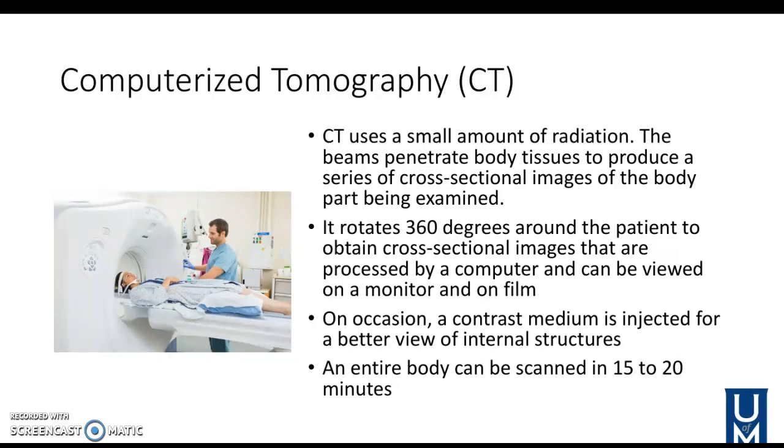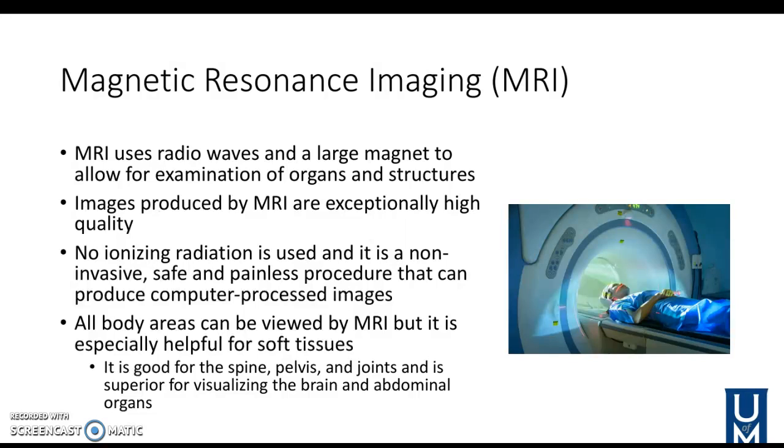And don't get this confused with an MRI. We see this picture of the machine here. It's more open than an MRI scan, and it doesn't take near as long as an MRI. And we're going to talk more about an MRI in just a few minutes, or just now.